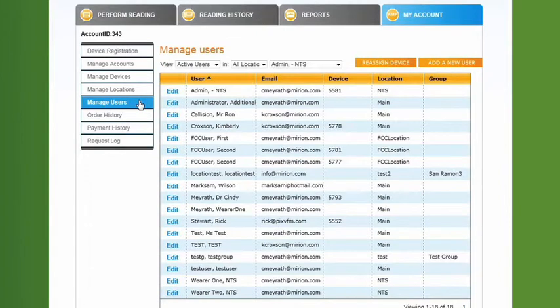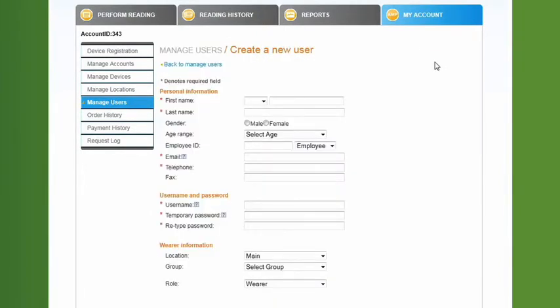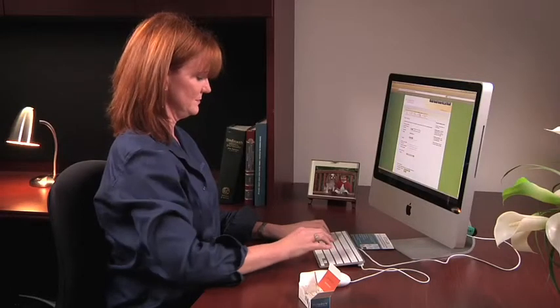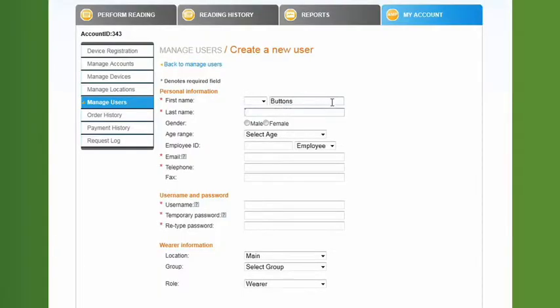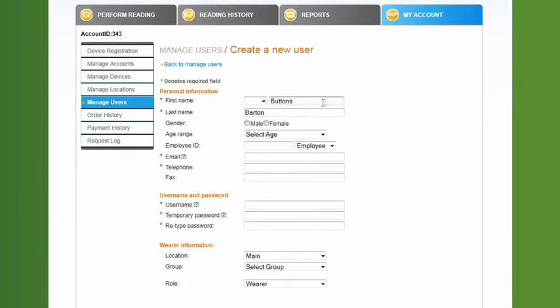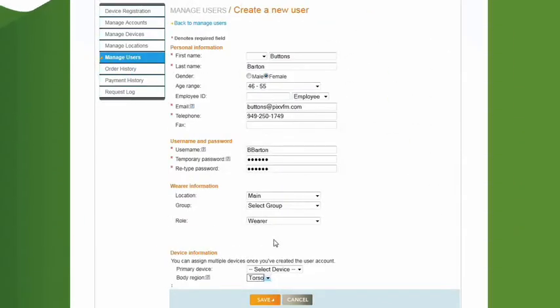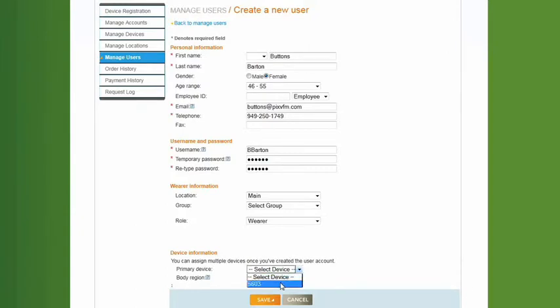Here we'll add a new user. The Create a New User screen appears. Fill in the information in the required fields as denoted by asterisks. Once you've created the user account, you can assign multiple devices from the pull-down menu under the Device Information section.